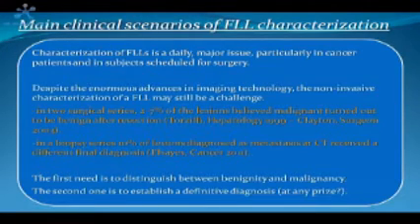Which are the needs? The first need, of course, is to differentiate benign from malignant. In the end, we will try to have a definitive histological diagnosis, but I wrote here "at any price," because probably for small lesions we don't really need to have a final diagnosis of FNH, adenoma or angioma. For very small lesions there is not, in my opinion, really the need to approach final diagnosis at any cost for the patient.